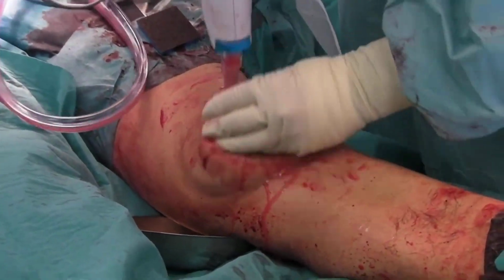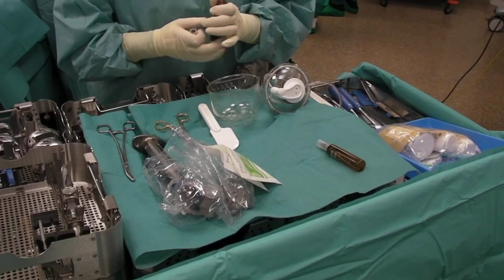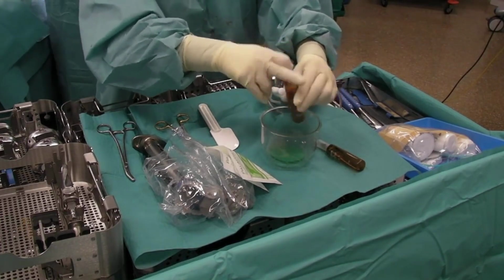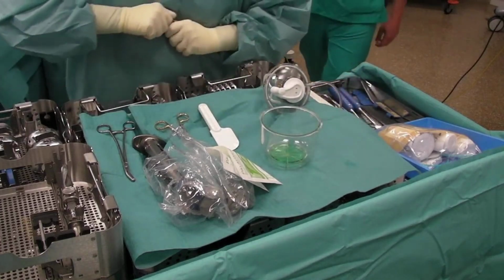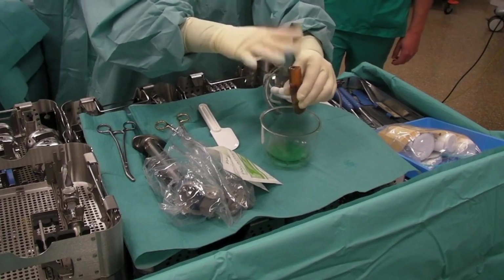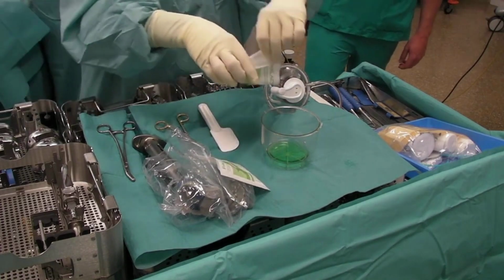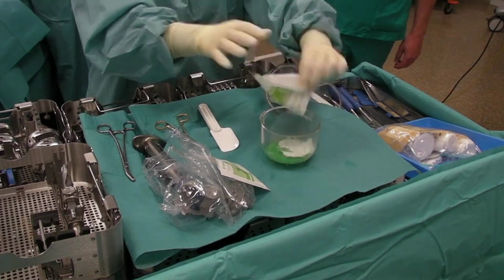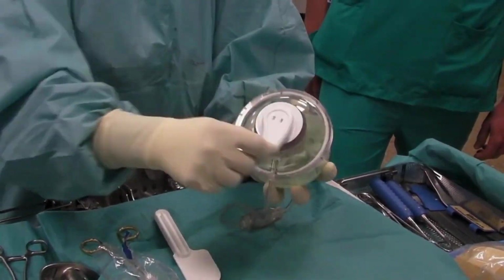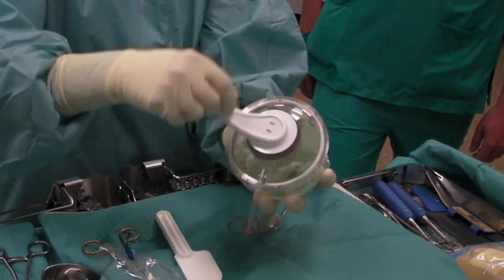While the surgeon uses a kind of gun that washes and simultaneously aspirates sterile water, the surgical technician begins to prepare the sterile cement. In fact, to ensure perfect and immediate adhesion of the prosthesis components to the bone, a kind of superglue is used, which is prepared by mixing a powder with a liquid that triggers a chemical reaction. This reaction takes place under vacuum. The surgical technician mixes the components until, after a few seconds, a paste is obtained, which is then applied to the prosthesis components that will be applied to the bone.